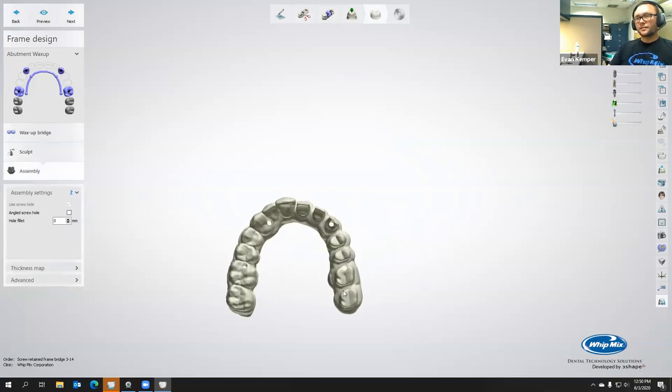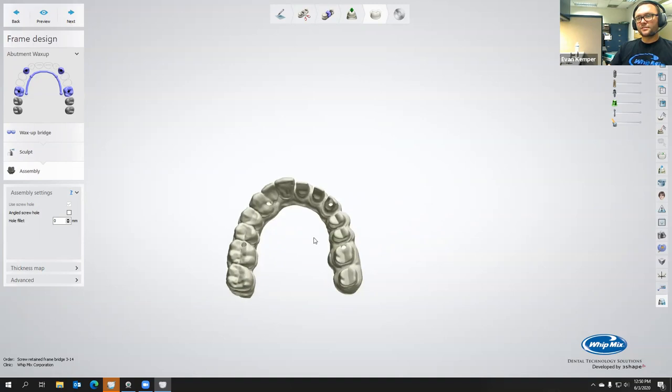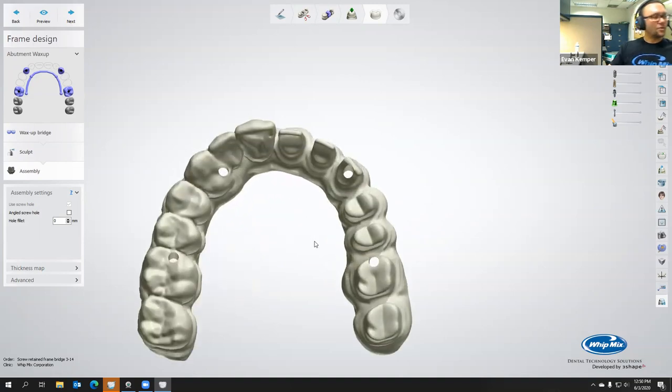So now, you can actually see if I were to hold this bridge back up where you can see it, these were all vertical screw holes in the design. And if you can see where the little blue dots are, they're basically in the exact same spot as what's on the screen. So whenever Bryce did this, using the multi-unit abutments allows you to change the screw hole location for the final provisional without actually using an angled screw hole in it.